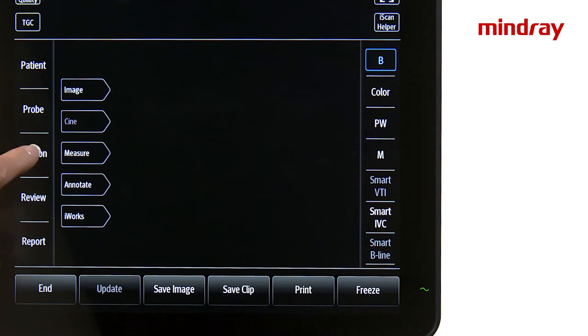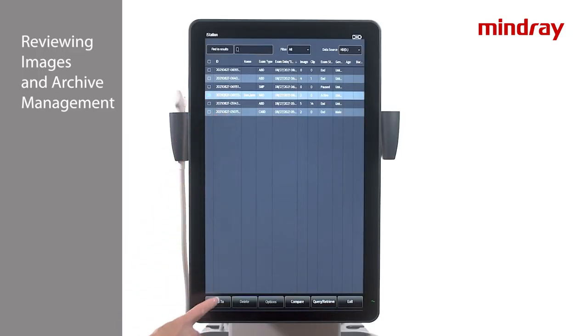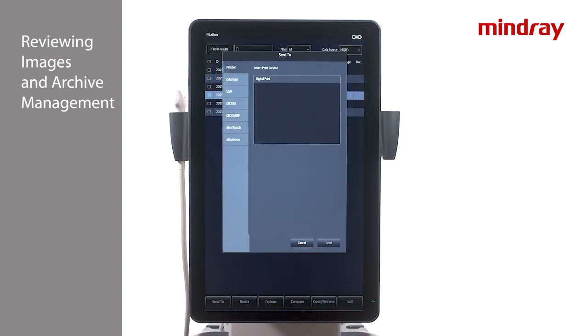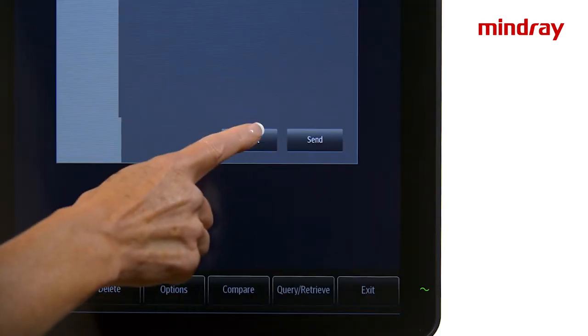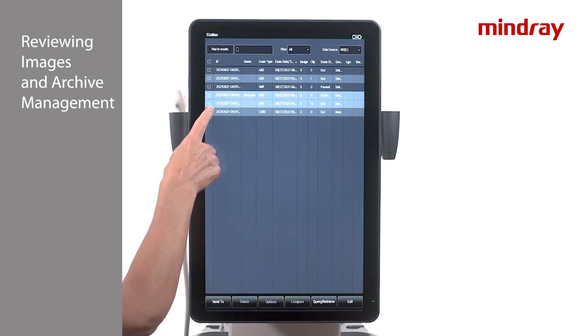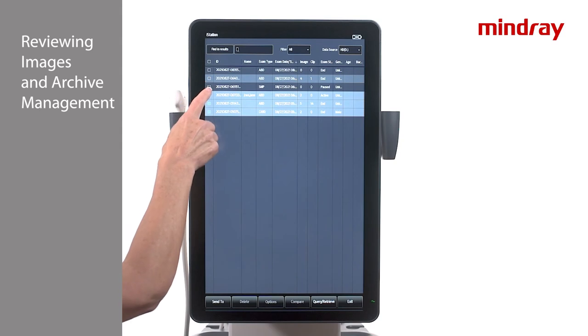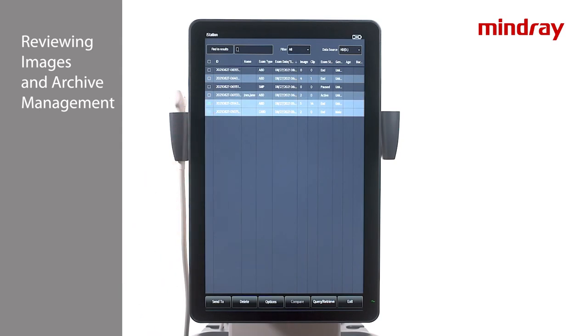To send images to an external archive or storage device, select the desired images and choose Send To at the bottom of the screen. To delete studies from the iStation archive, highlight desired exams leaving the most recent exam unselected, then select Delete at the bottom of the screen.